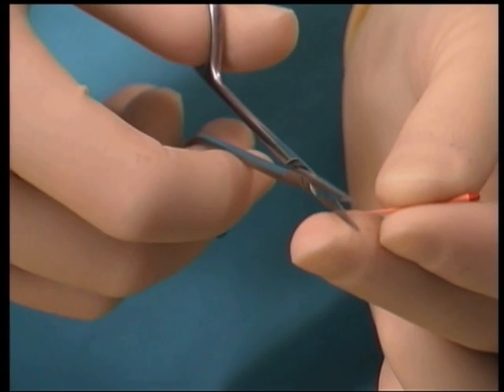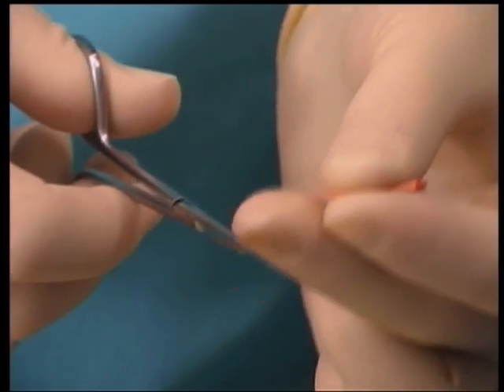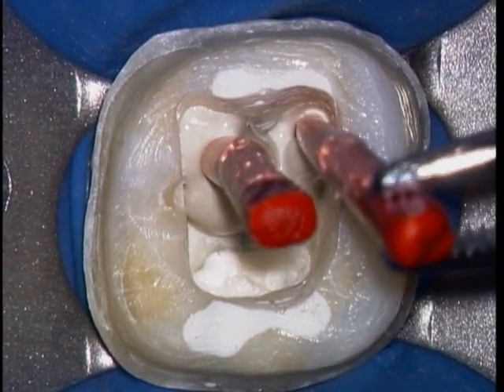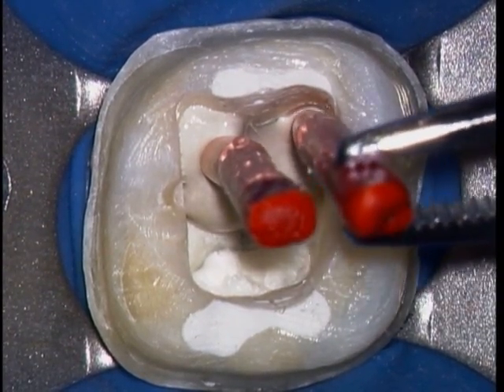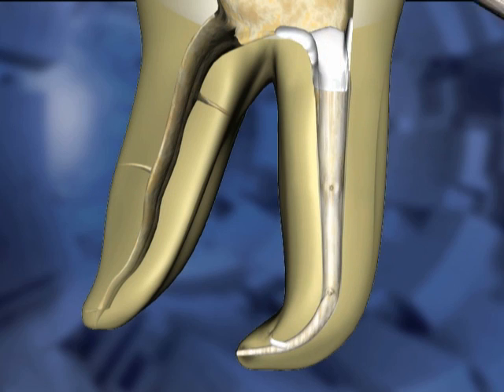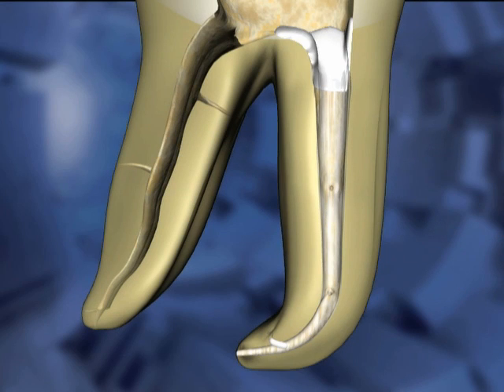About a millimeter is clipped off the apical end of the cone. It is then coated in sealer and reinserted into the canal space. The sealer adheres to the canal walls as the cone is worked back and forth. A thin coat of sealer is desirable for these techniques — in this animated example, we remove the cone to show that there is still some sealer on the cone, as well as the coating left on the canal walls. The cone is reinserted to length.